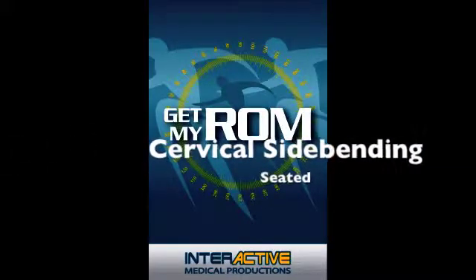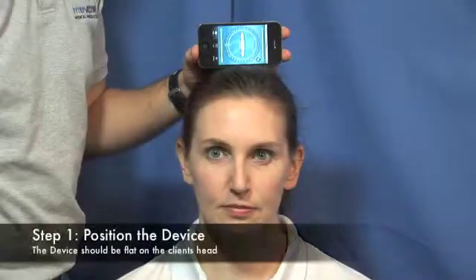GetMyROM Cervical Sidebending Seated. Begin by placing the device flat on your client's head.